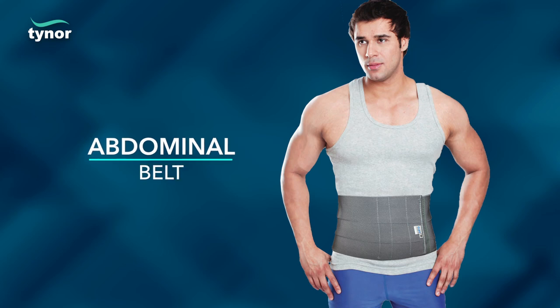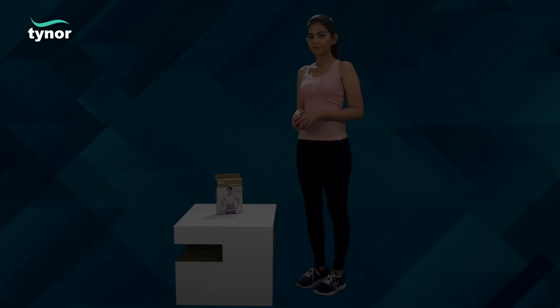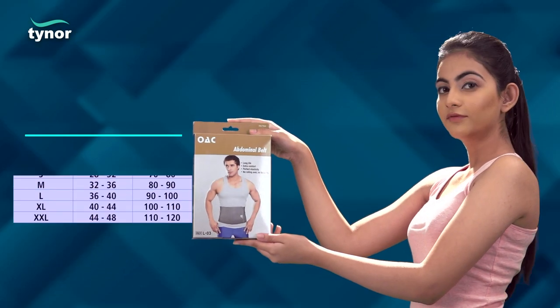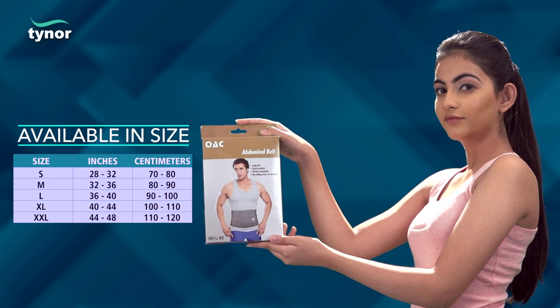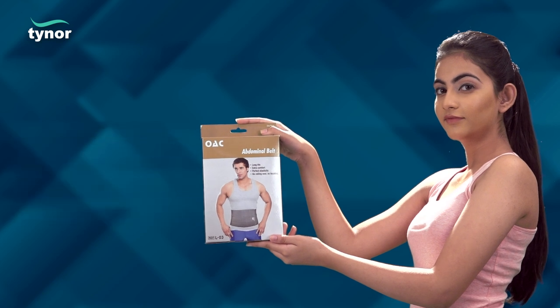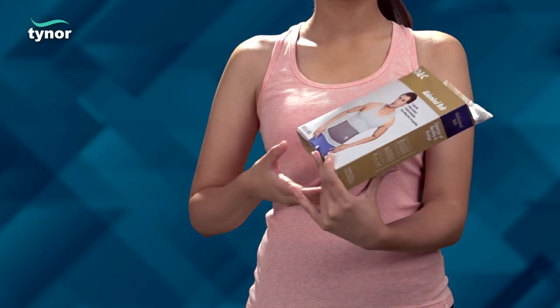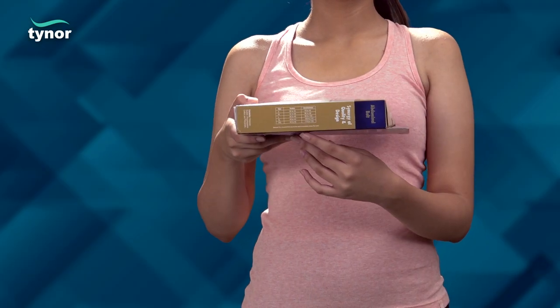Here we will discuss how to measure the size and how to use the abdominal belt. The abdominal belt is available in five sizes. Measure the circumference around the waist immediately below the navel, then refer to the chart printed on the box of the product.